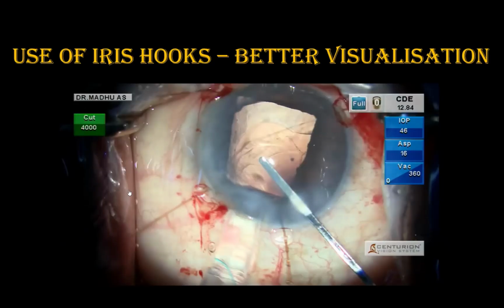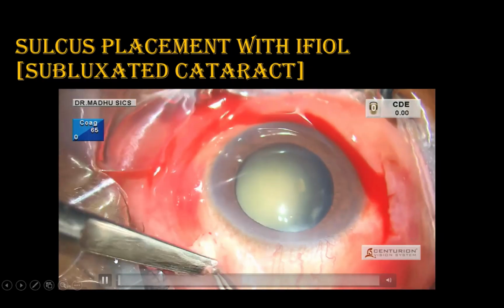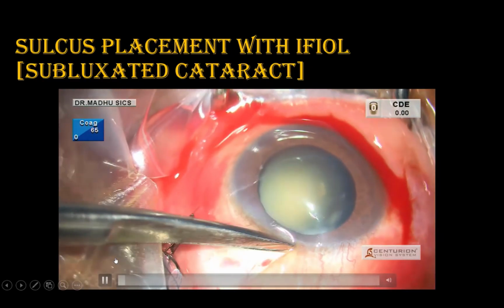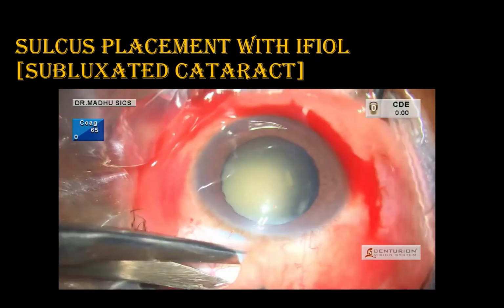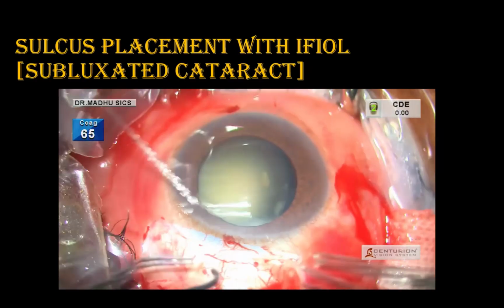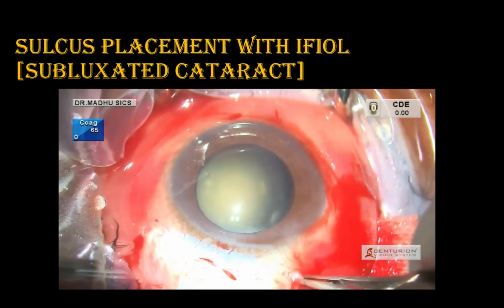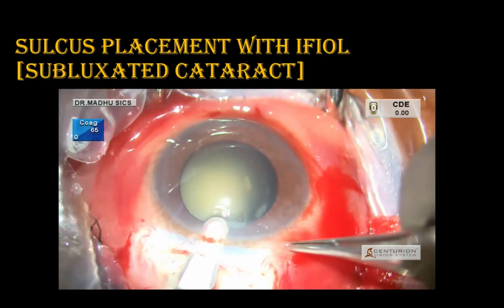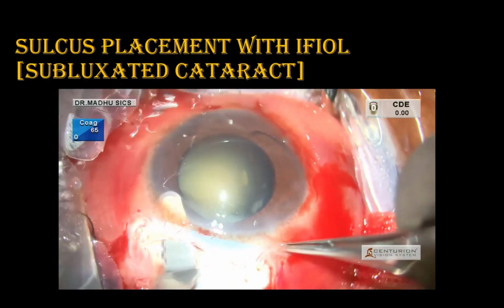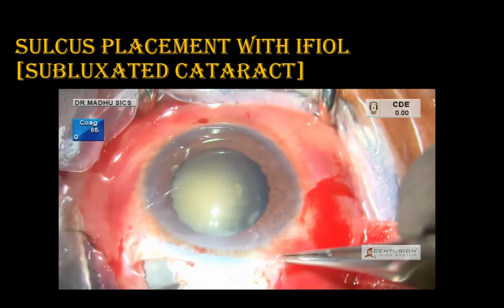Like in this case, it was a subluxated cataract, where one side support was good, but around 3 to 4 clock hours, support was not good. So in this case, I have placed one haptic in the sulcus and the other haptic I have sulcus iris fixated, how it was shown in the previous videos.